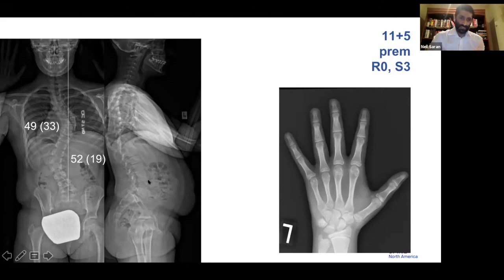On the sagittal, if you look, she's got some kind of anomaly. Probably has a spondylolysis down at L5. She has a little spina bifida down there. So I don't know, Stefan, any comments? No, I agree with you. I think the thoracic curve is fairly stiff. The flexibility of the lumbar curve is good. Typically, I don't do double tethers, but I think in this case it's probably worthwhile to discuss.